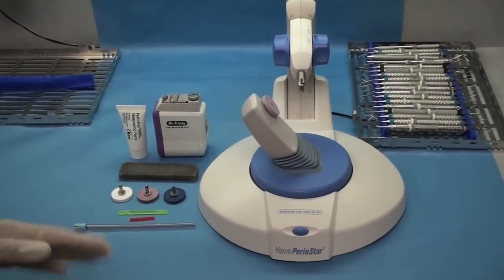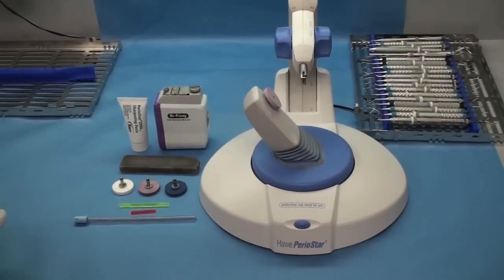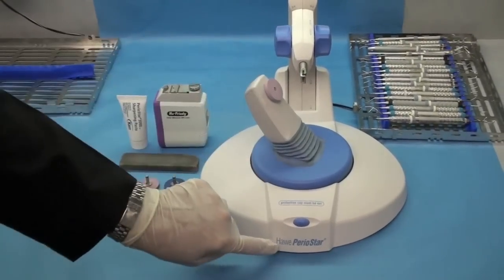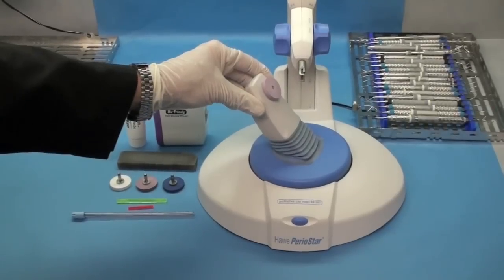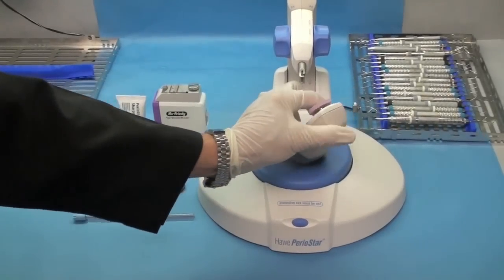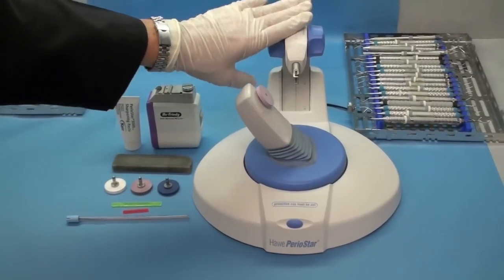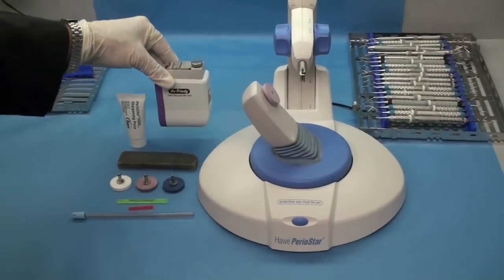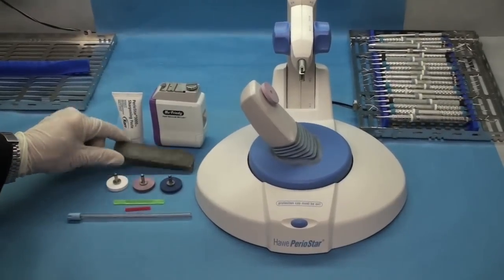Here are the three instruments that we're going to use for sharpening our perio instruments, our scaling instruments. This is the Periostar by H-A-W-E, Howe. They make it and it swivels. And I'm going to go into detail on how to use everything. Here's the Periostar, here is the Hu-Friedy Sidekick, and here is a hand stone.